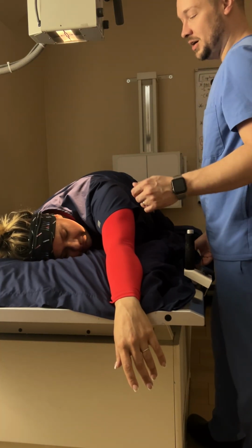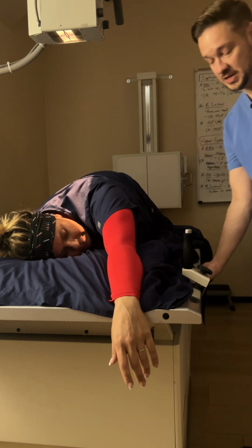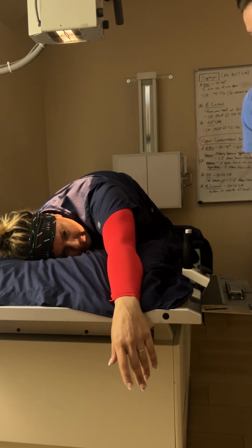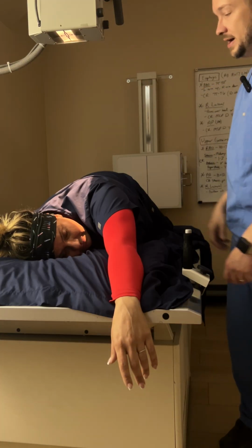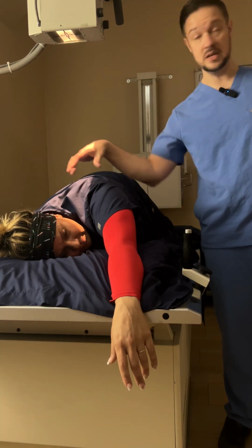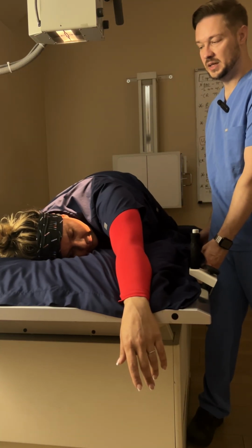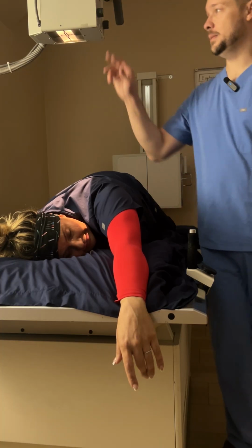So when you're doing the RAO, you're going to be centering a little higher than you would for a chest x-ray, which means you're going to have about 2 inches above the top of the shoulder, okay? Whereas maybe for a chest, you would only have like an inch and a half, okay? Centering a little higher, because the esophagus is going to be thrown slightly onto the left side. As you see it here, your centering is not going to be exactly on the MSP, so it can be a little to the left side as you see the patient, okay?